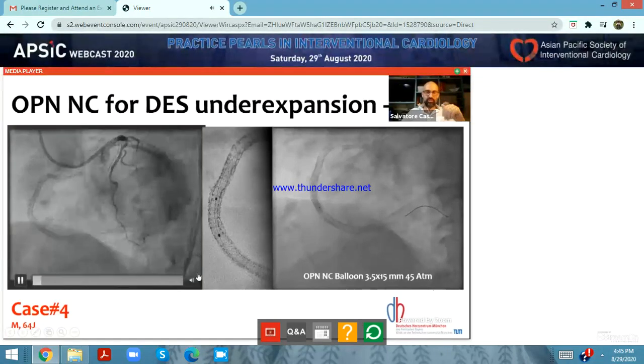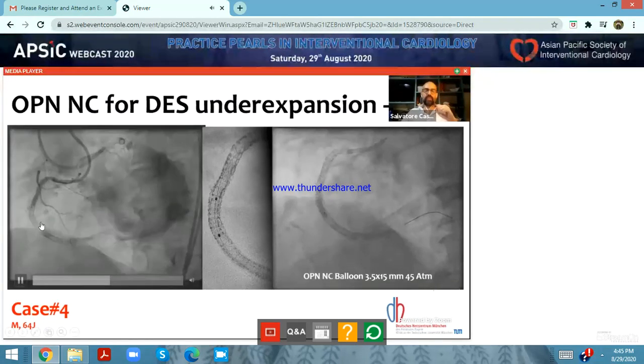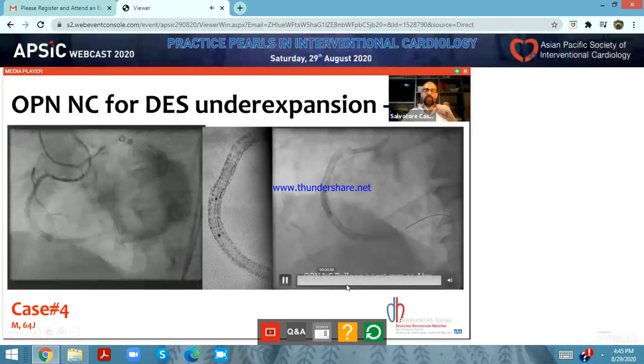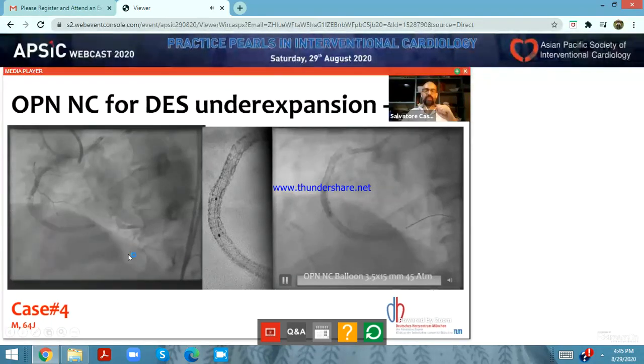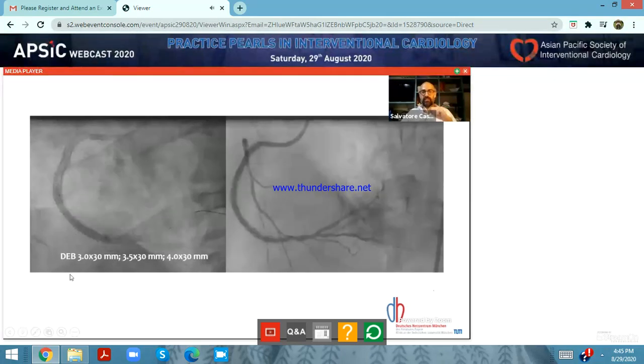Take a look at this patient who presented at our institution, a gentleman, very young, with already multi-metal layer in-stent restenosis. The last one was an occlusive in-stent restenosis. It was treated with recanalization, OPN, it means ultra-pressure balloon at maximal atmosphere, and then three drug-eluting balloons were used in order to avoid further metal in this vessel, and there was a satisfactory result.